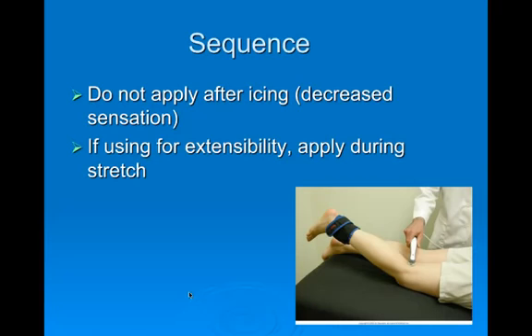Okay, we already talked about applying during a stretch, which is a good idea because your window is pretty narrow after you've done your ultrasound treatment.